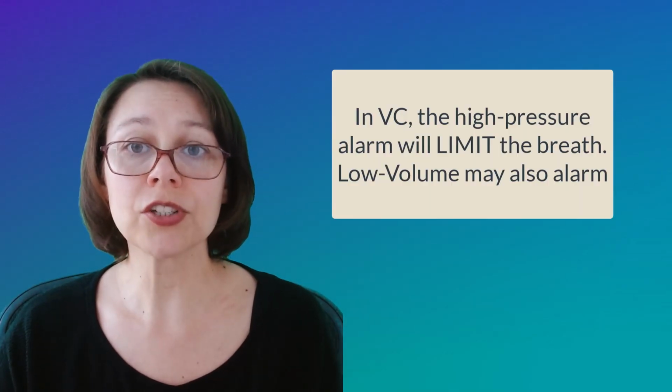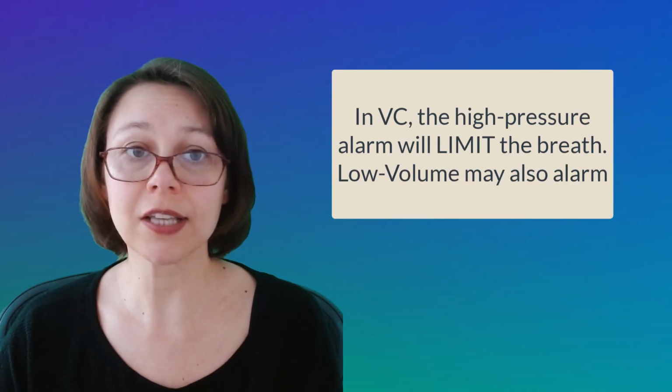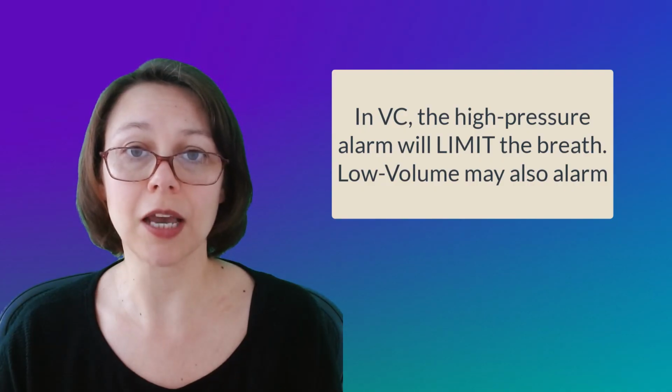It's not going to allow any higher pressure than that alarm limit to be delivered to the patient. So if the patient is in volume control, then inspiration will end, even if the set tidal volume has not been delivered. This means that you might get a low volume alarm at the same time as high pressure. If this occurs, it is important that you understand that the issue is really high pressure, and you need to identify why that is happening.